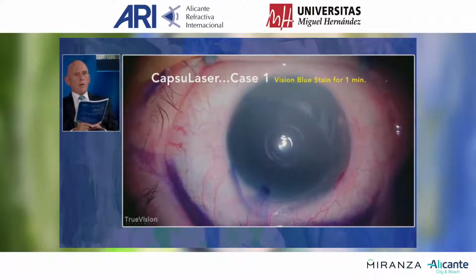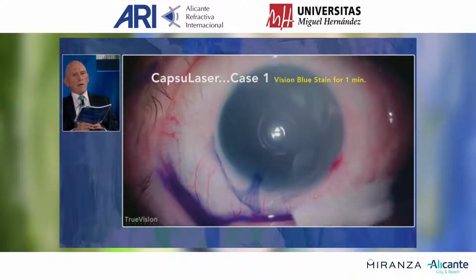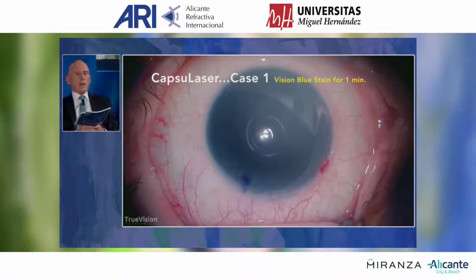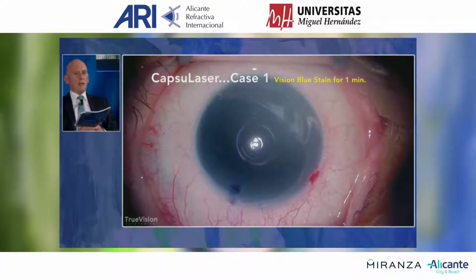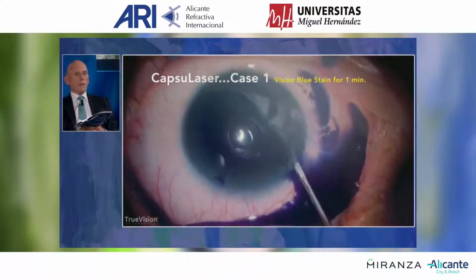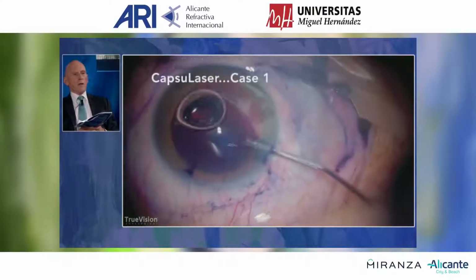We protect the epithelium because it's important not to have any type of damage to the epithelium. It really doesn't matter that much, but it's not elegant. And we leave the dye for 60 seconds, with a small bubble that we use in order not to have any staining in the central endothelium. Meanwhile, we are opening because we are going to do a coaxial phacoemulsification. And now that we have been waiting for 1 minute, we are just washing out the dye.